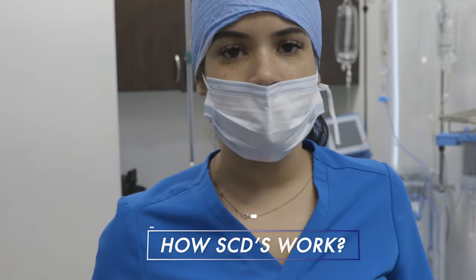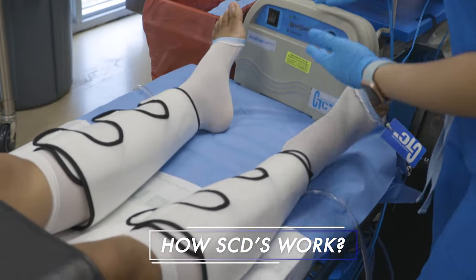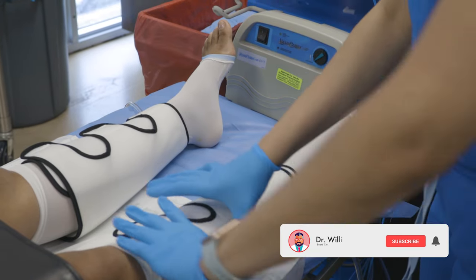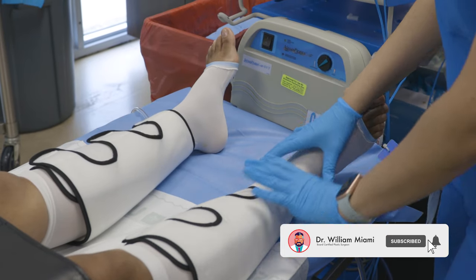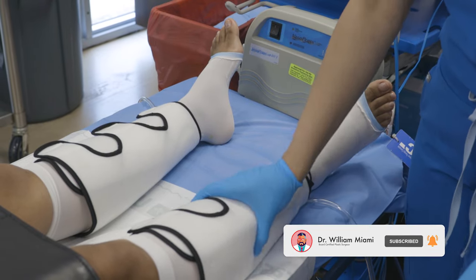The way the SCDs work is by mimicking the legs walking. We can see here how the SCDs compress the legs from the ankle, to the mid legs, to the calf. It promotes outflow throughout the body — so it will squish here, here, and here.